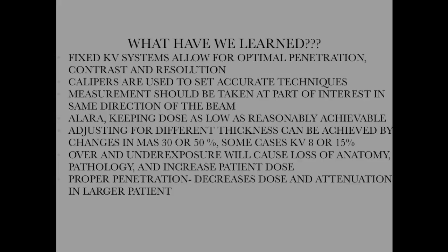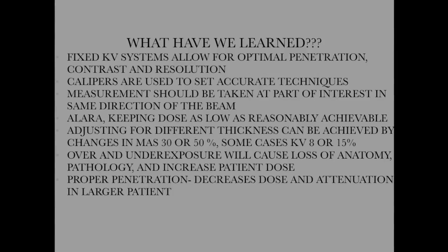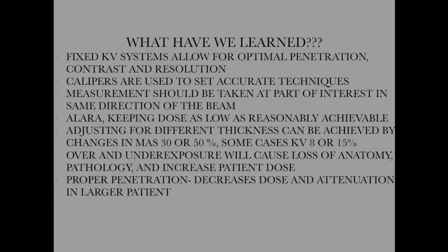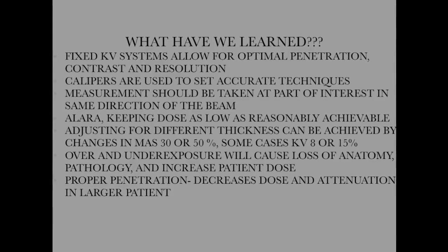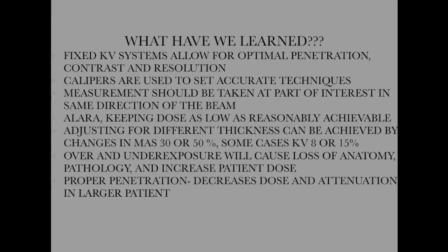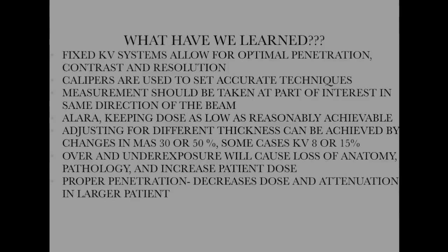So what have we learned? We use fixed kV systems for optimum contrast and resolution. There's an unfortunate fact to consider that as the size of the patient increases, the attenuation will also increase unless there is a factorial change. To aid in setting proper technique, we use calipers to measure patient thickness by placing calipers over the part of interest and measuring thickness in the same direction the central ray is directed.